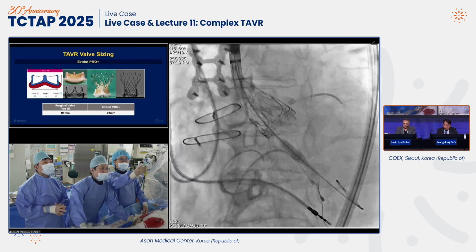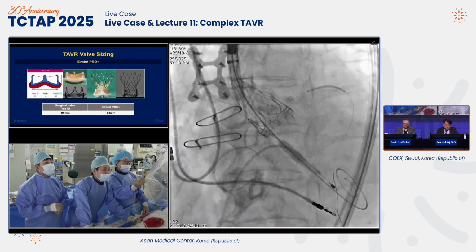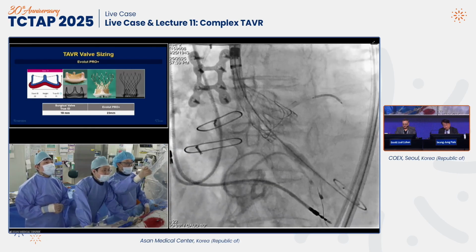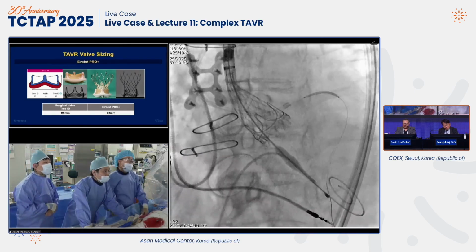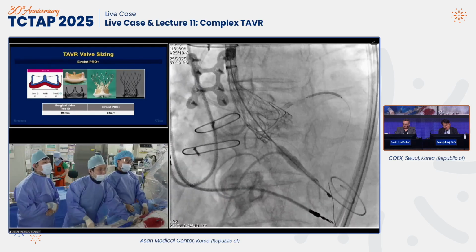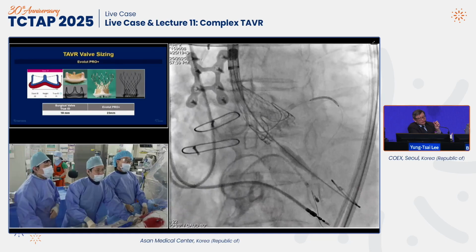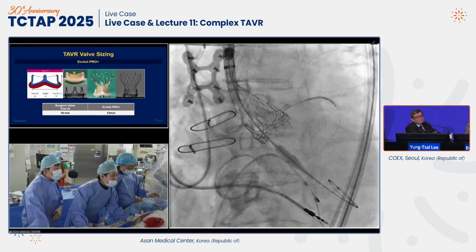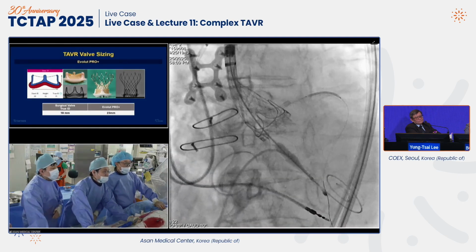By recommendation, we are usually trying to do an inflow view and keep about 3 millimeters from the prior surgical valve. I think the position is... You feel like you're at 3? Any panel opinion? The metallic rim is not the sewing rim, because the sewing rim should be 1 millimeter lower than the metallic rim. Yeah, sometimes the enemy of good is perfect, but okay, we can put one more time.